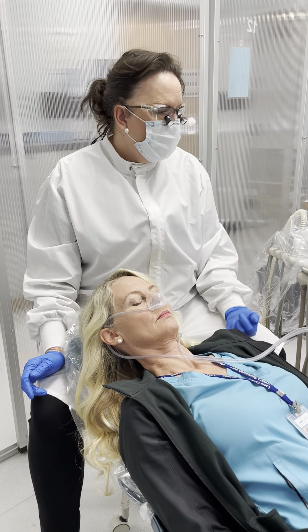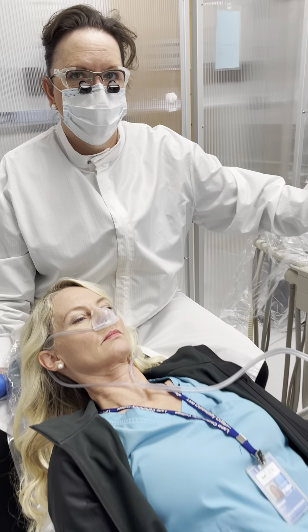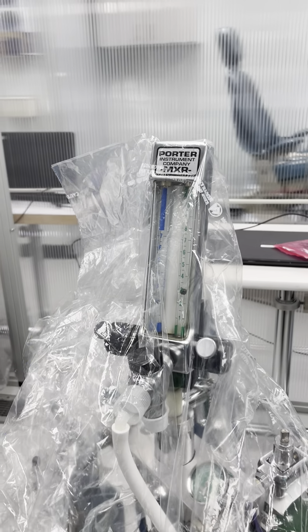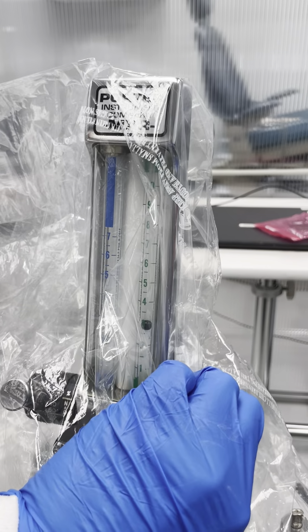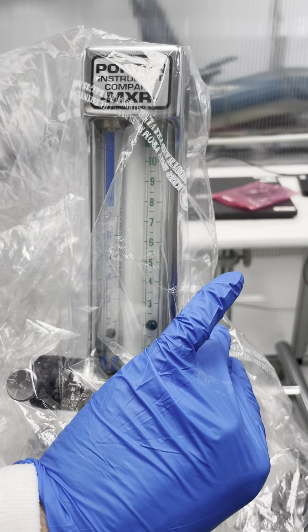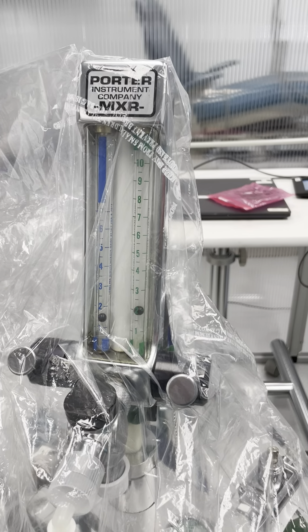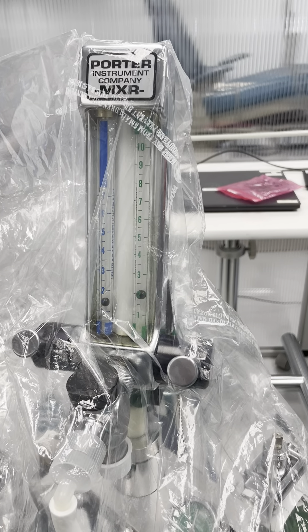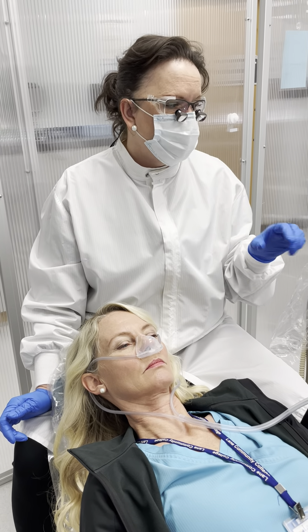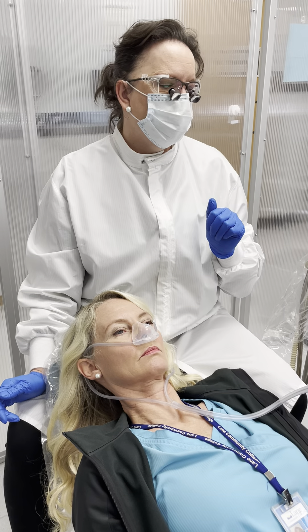Once at optimum percentage, you can actually lower the overall volume because this Silhouette system doesn't need as much gas as the old system. When you lower the oxygen, you can see the balls change but the percentage — the same proportion of oxygen to nitrous — is maintained. Keeping her at 2 liters of oxygen and 1.5 liters of nitrous stays closer to the ideal 3 liters total for this system. For large individuals you can start at 4 liters, but you shouldn't need to use the old 4-5-6 rule used with the bag system.